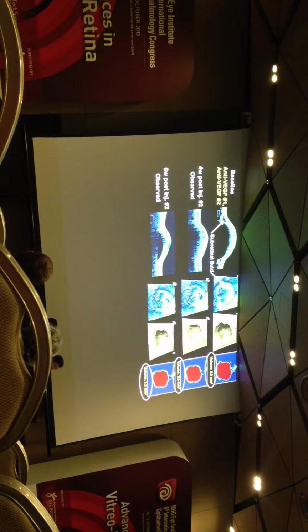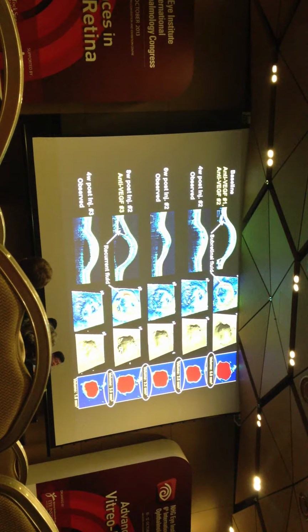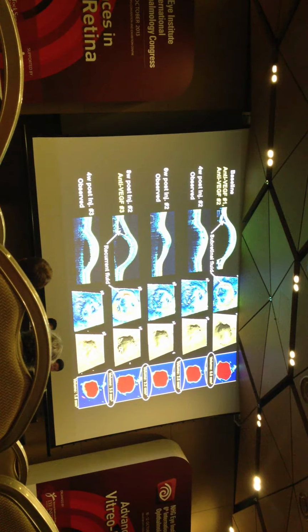Maybe you can appreciate here in the RPE segmentation map. So we decided to watch. Since the patient was coming back 2 weeks later, the patient comes back. Lo and behold, here's the fluid, okay, and the volume has increased. So we treat, and not surprisingly, the PED volume goes back down. And if you notice, the fluid's gone. So this was an interesting observation.